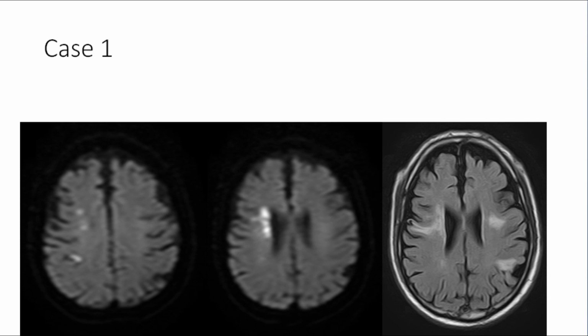And this is watershed. And the etiology for watershed is critical stenosis. And that critical stenosis is somewhere in the neck vessel or the intracranial vessel. Okay, so we need to know that. So the next imaging for this patient is going to be CT angiogram.